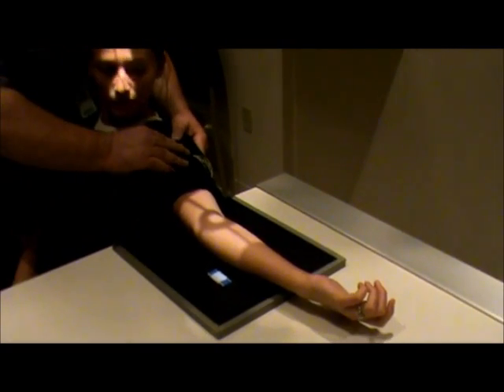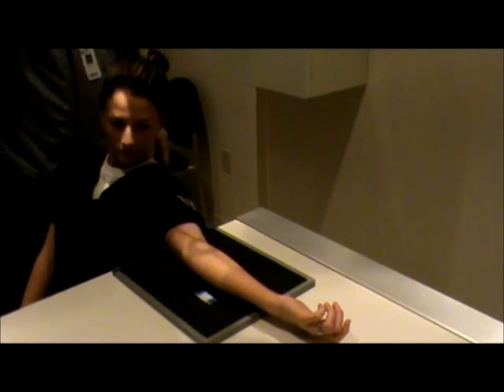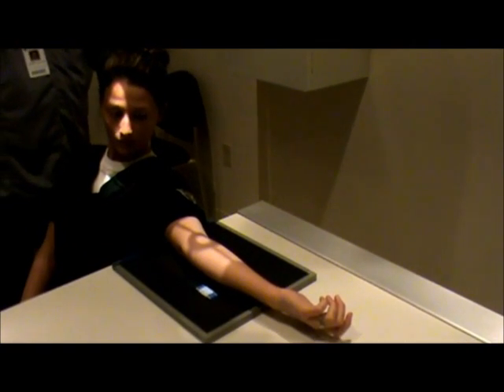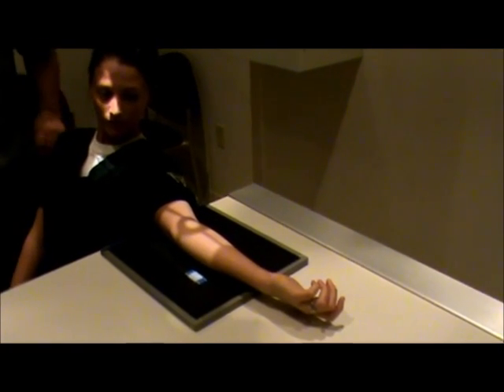Sometimes you may have to have the patient actually rotate a little bit more to get the 45-degree oblique. Technical factors stay the same: 55 kV at 8 mAs. This is the external oblique elbow.